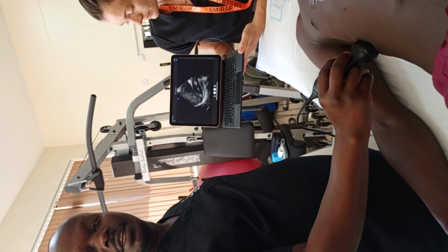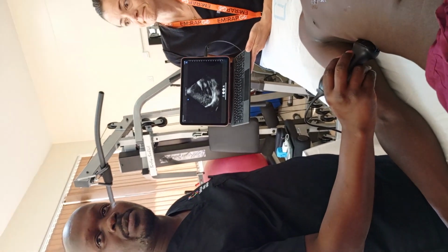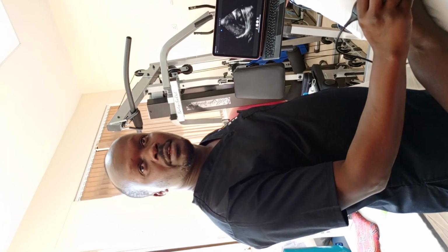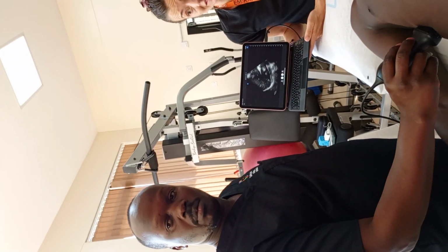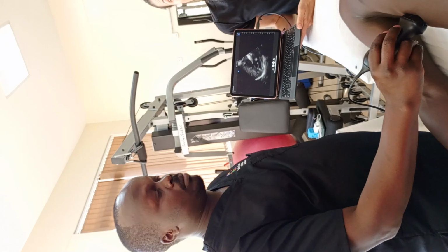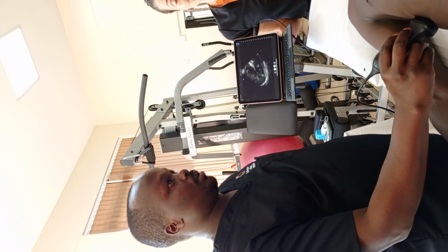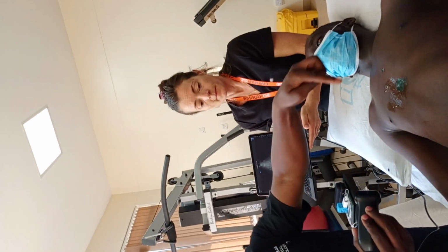Also, you find even in the case of ruptured ectopic, that's a non-trauma case, there will also be free fluid around the space. So sometimes a pregnancy test might take a really long time to come back, and this person maybe hasn't had a period for 3 months and is having excruciating abdominal pain and is hypotensive. I want to know if they have free fluid in their abdomen, because then that's really an ectopic pregnancy until proven otherwise.